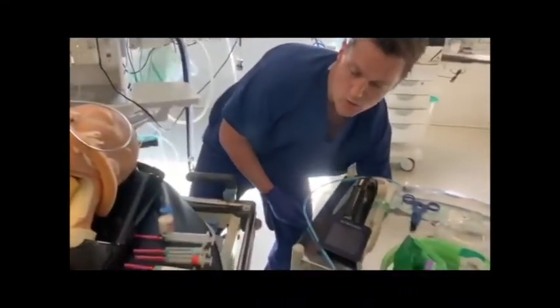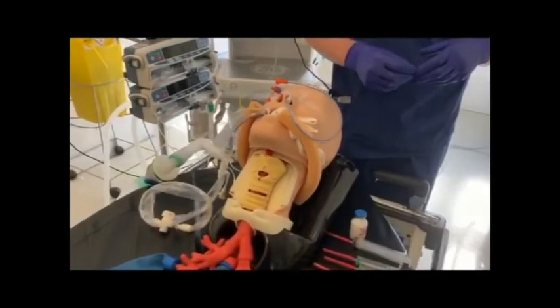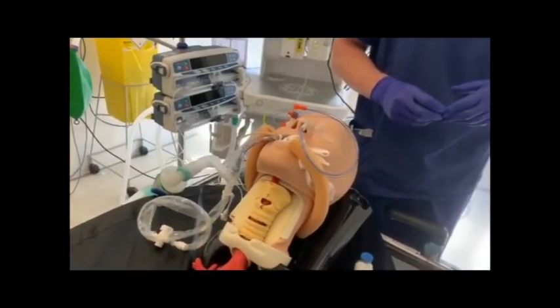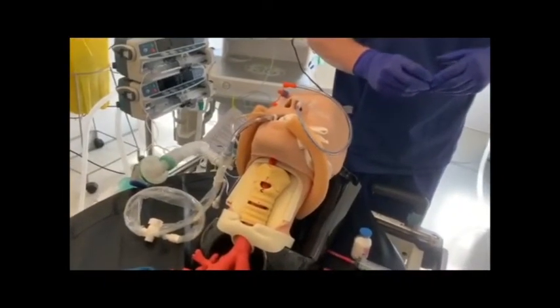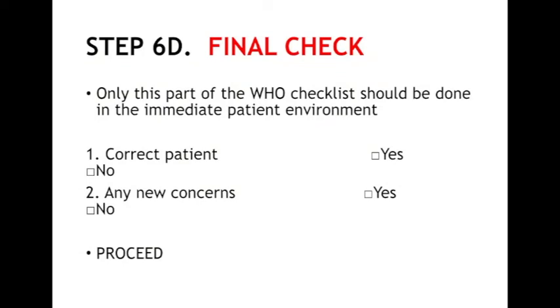The tracheostomy and the new circuit with inline suction and nebulizer will be given to the scrub team beforehand so that they can prepare to connect to the tracheostomy once it's inserted. As previously outlined, the patient is positioned and the procedure is commenced until the point that the trachea is prepared but not incised.